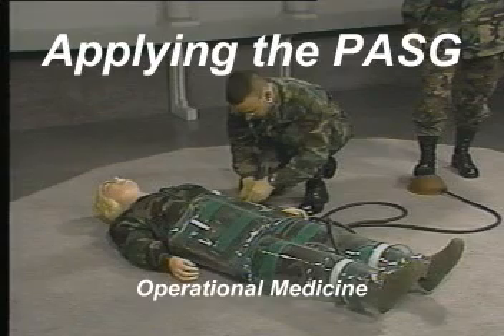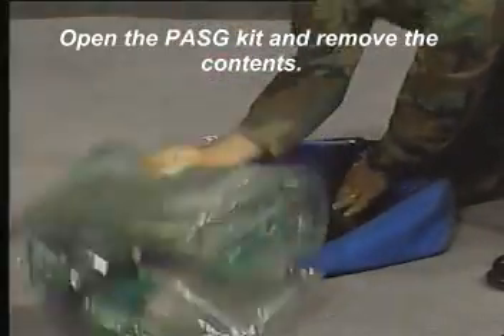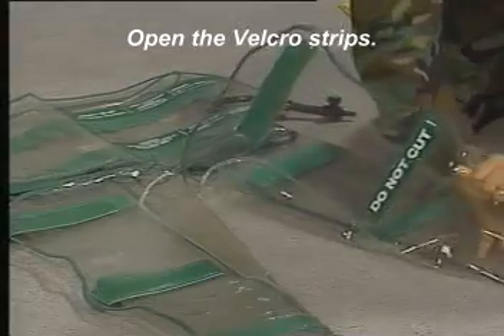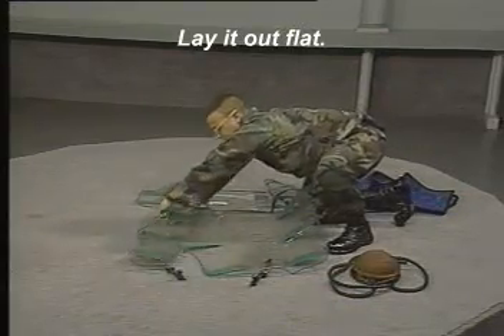Applying the pneumatic anti-shock garment. Open the PASG kit and remove the contents. Open the velcro strips and lay it out flat.